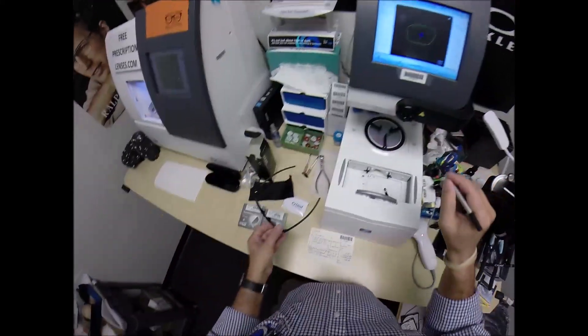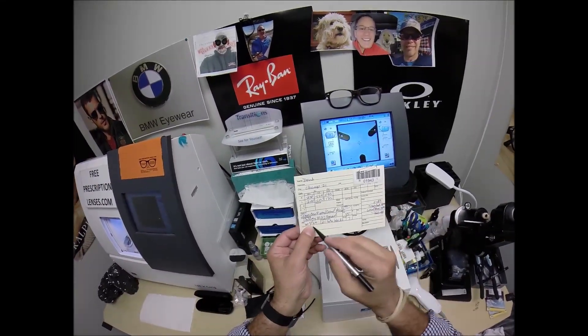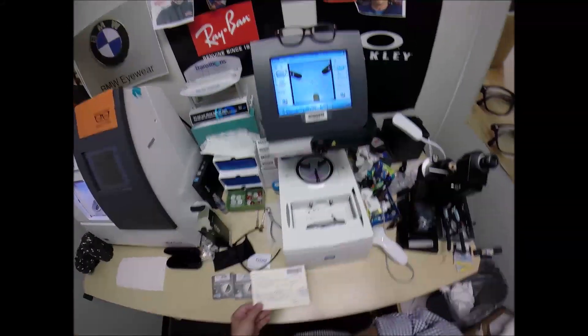Let me go ahead and hit the green arrow, which moves on to the next screen. That's the shape that I'll be cutting. Your pupillary distance for the right eye is 30.5, so I'm going to tap the minus button until we get to 30.5. I do want to raise the optical center height up to 20.